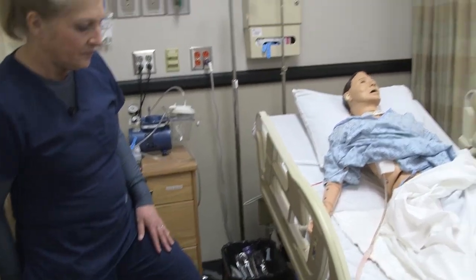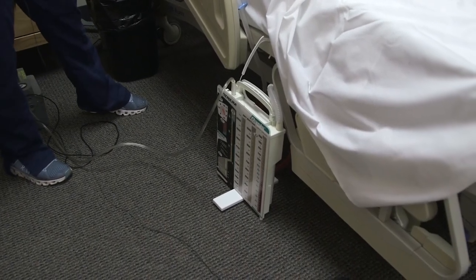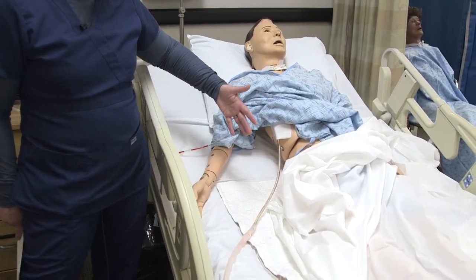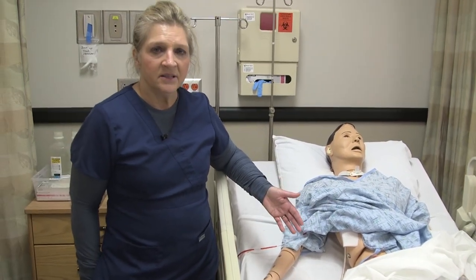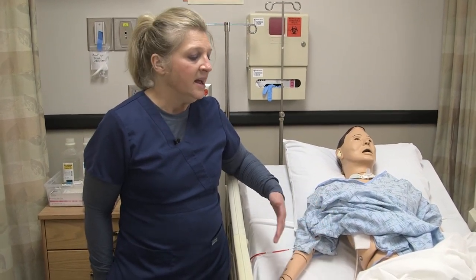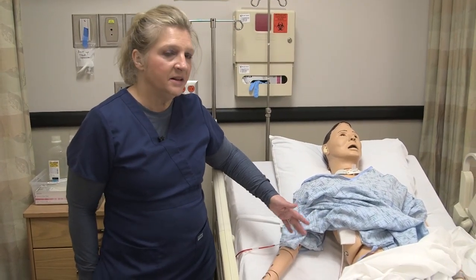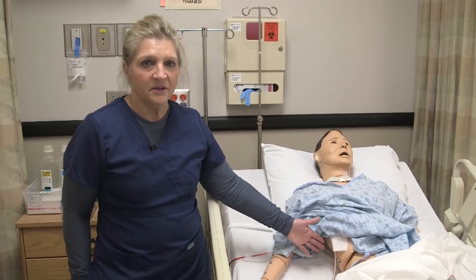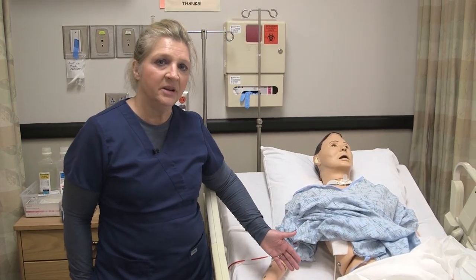This patient here has a dry chest tube system placed. A couple of things you want to do every shift: make sure you're assessing the patient's respiratory status, checking their lung sounds, respiratory rate, vital signs, and oxygen saturation to ensure it's within appropriate parameters, and watching for any signs of decompensation. Another assessment you'll want to do is a pain assessment, because they do have a tube located within their chest wall and will have some pain that needs to be addressed and treated as needed.